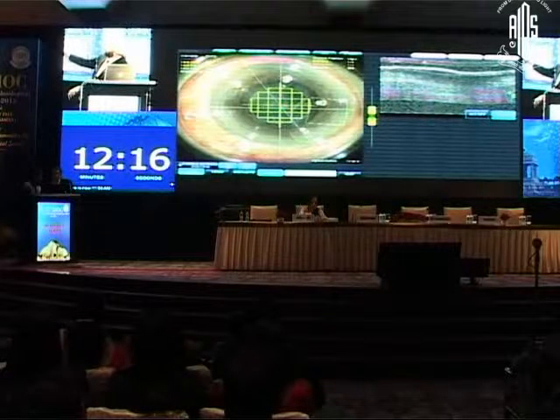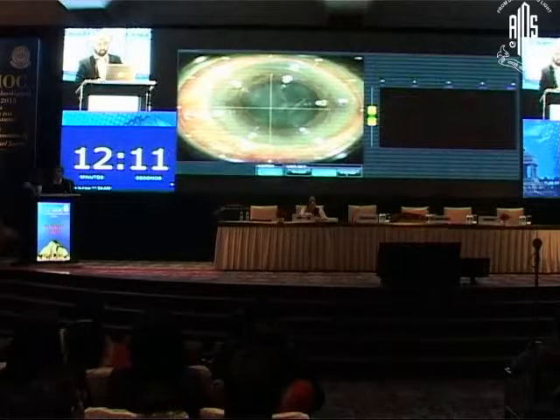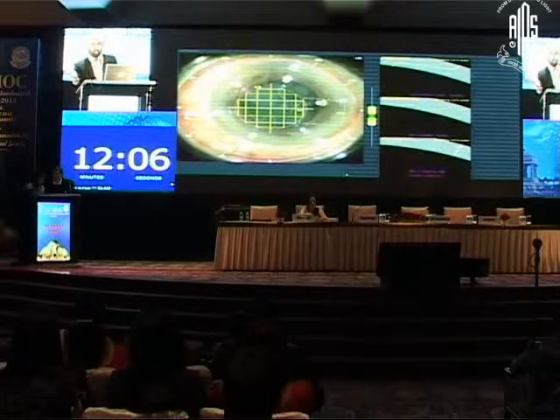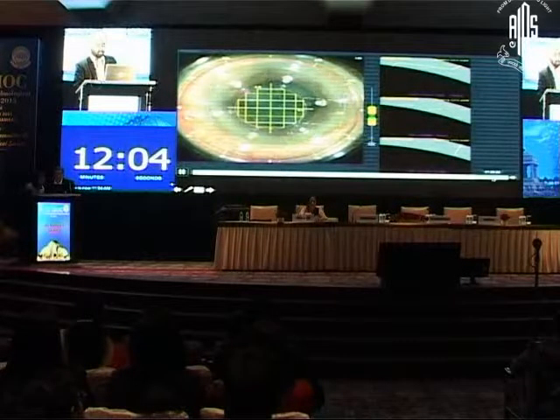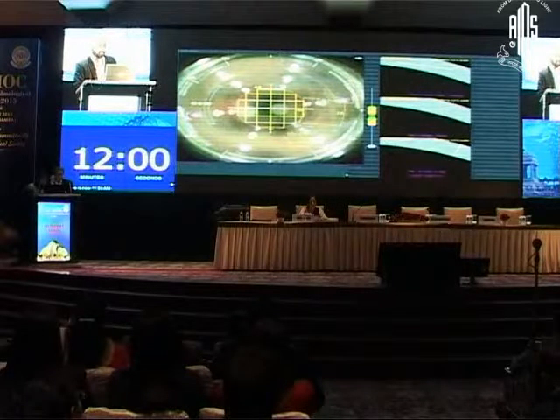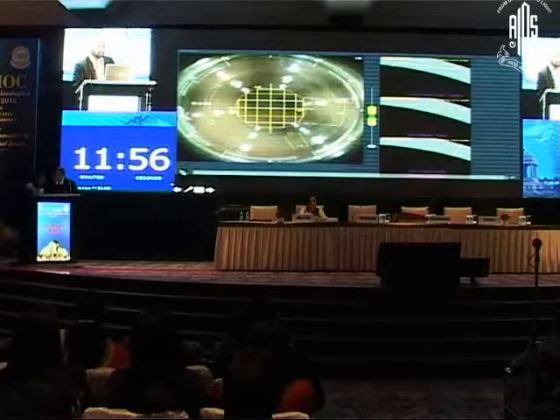So I tried 2-3 times, 4 times. I again dock, but really it does not come through. So I have to abort the procedure. I have to go away from using femto assistance in this eye where I wanted to. So that's my first failure. That's the first challenging situation that I had.